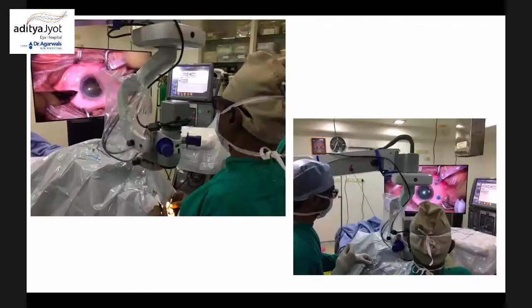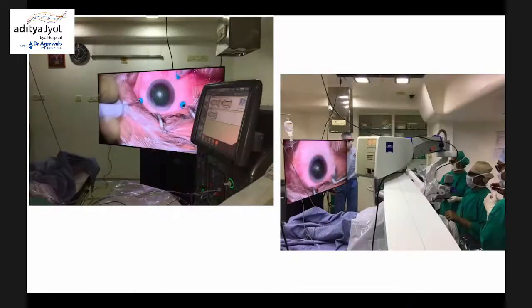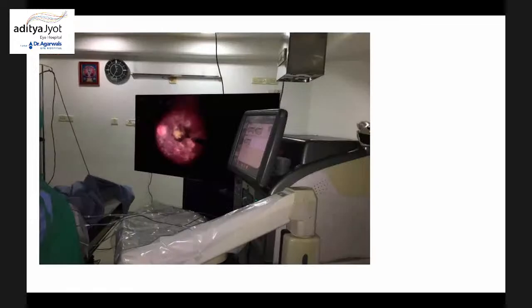And this is how the OT looks, the view from my side and then the machine on the right. So this is how we can operate, and then we can demonstrate. You can see exactly what I'm seeing. The students can see.